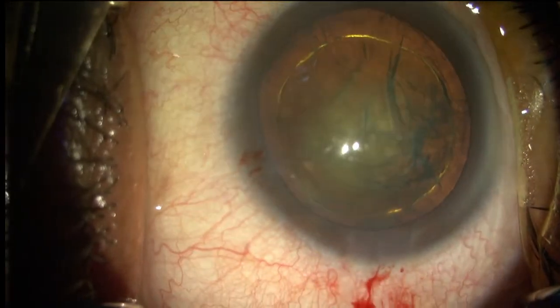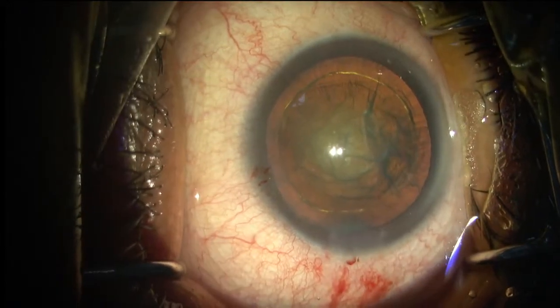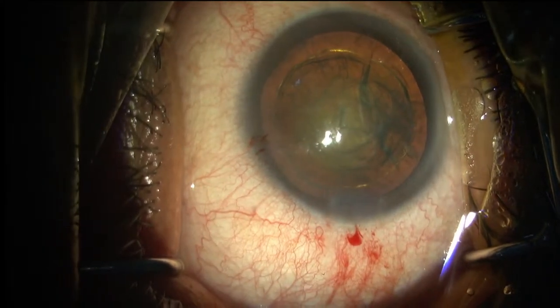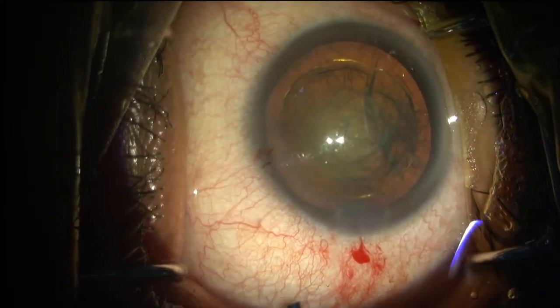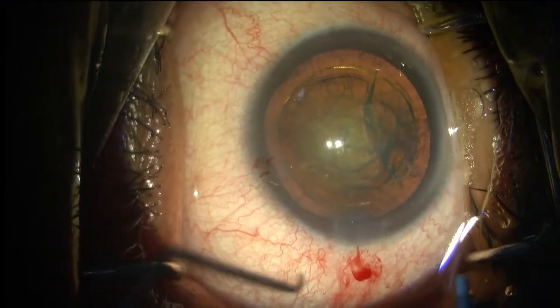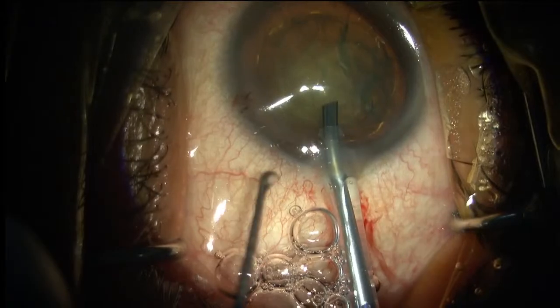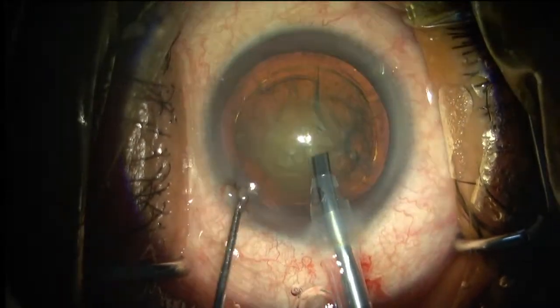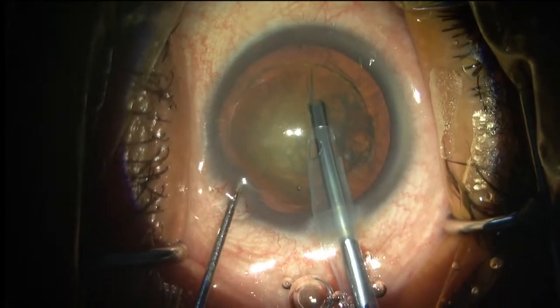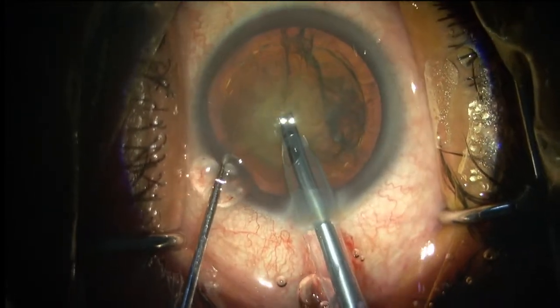Hello, can you see this surgery? Okay. So I'm going to use the Kelman tip, and that is my preferred tip. And I always use an incision size of 2.2 millimeter. I'm going to operate on a Signature Pro phaco machine. It is an excellent machine, and it gives very good chamber stability even at a high vacuum. That means when I operate a hard cataract, I usually use a setting of 600, 650.